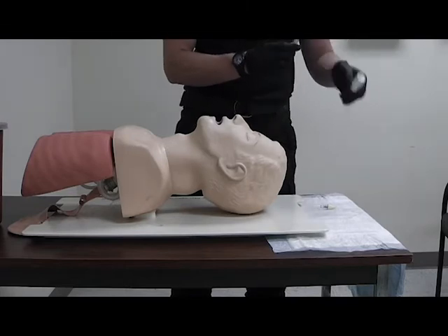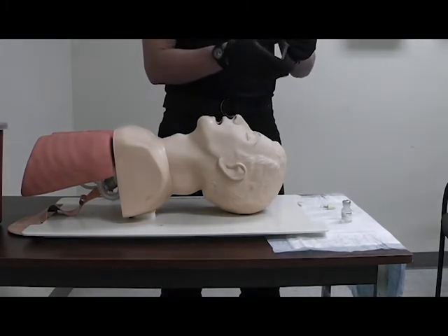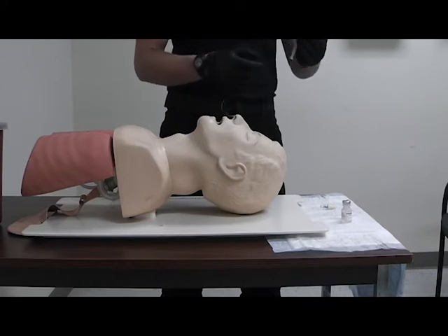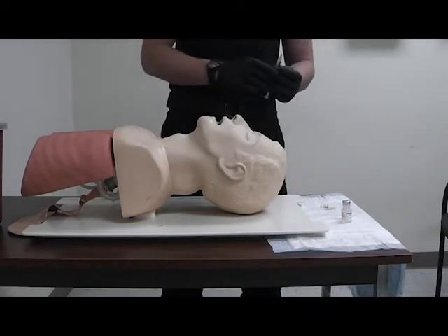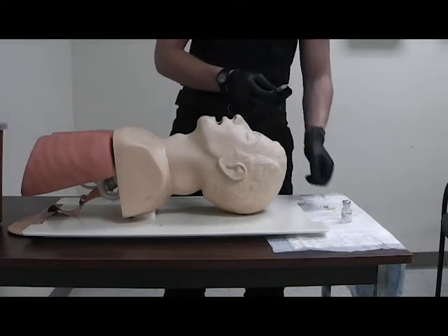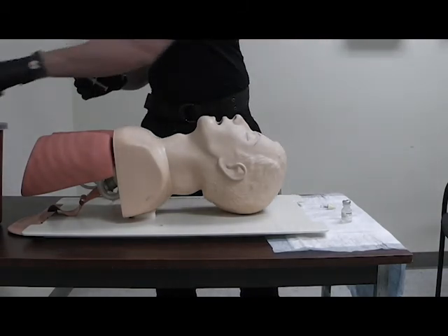Draw a little bit extra to vent fluid, then vent air. Double-check NCCCE and Dr. PATCH — all good. Then disconnect the needle and sharps away.